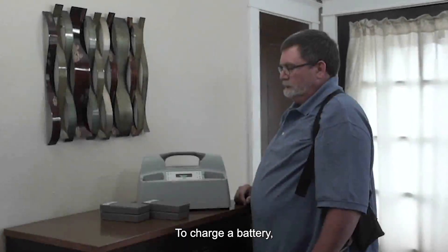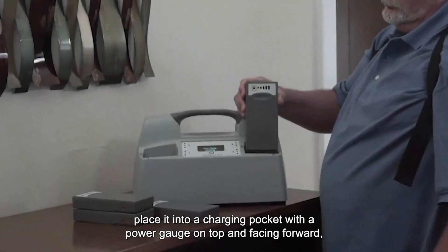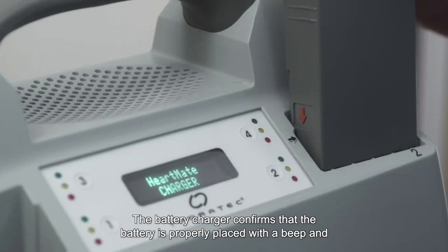To charge a battery, place it into a charging pocket with the power gauge on top and facing forward, aligning the arrow on the battery with the arrow on the charger. Never try to force a battery into a charging pocket. The battery charger confirms that the battery is properly placed with a beep and a pocket light.